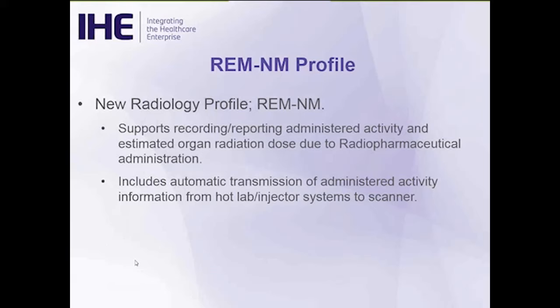One of the other side advantages of implementing this profile is that it also allows us to automate the transmission of information about what was administered to the patient from the hot lab systems where that is done into the scanners. The PET and nuclear medicine image IODs require some information about the radiopharmaceutical, the dosage that was administered, and some other parameters, and in many or most institutions that employs a sneaker net of some sort at this point, as the operator has to manually re-enter some of this information. So within REM-NM, we have the mechanism to automate that process as well.